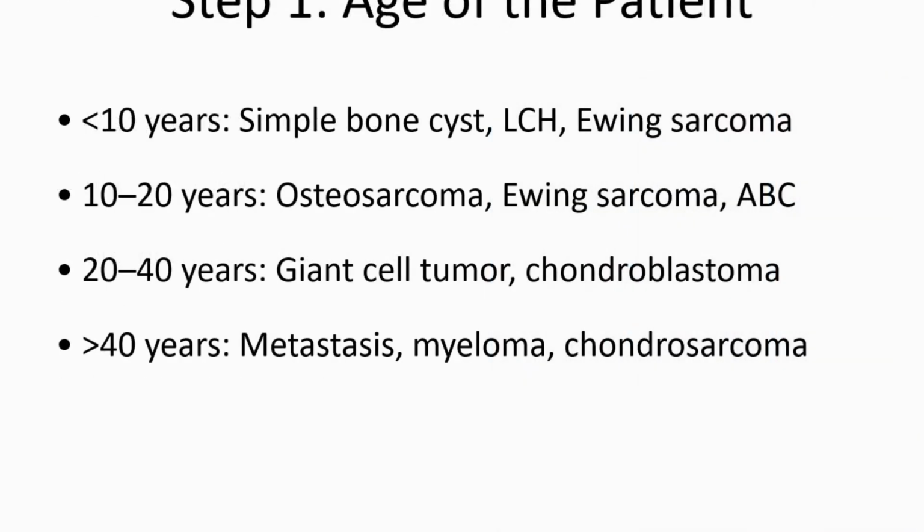In this video, the systematic approach for bone tumor diagnosis is divided into different stages. So step 1 is the age of the patient. First look at the patient's age.